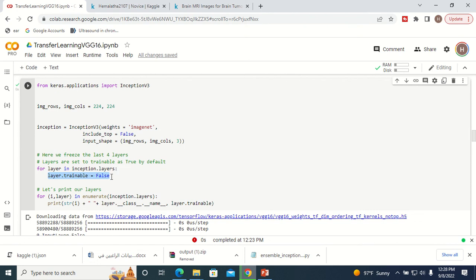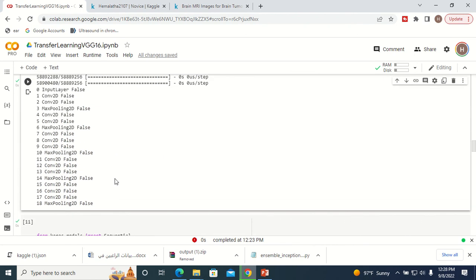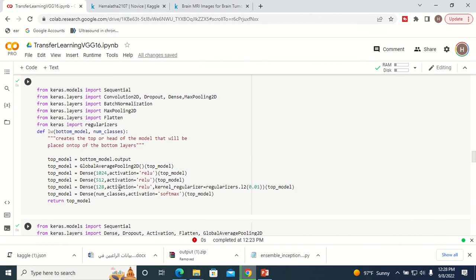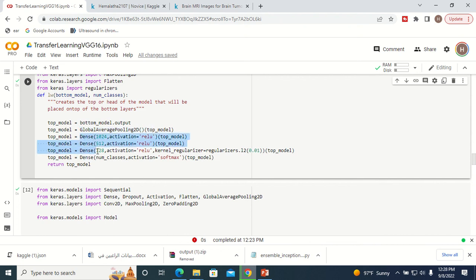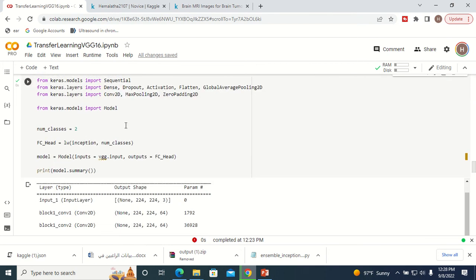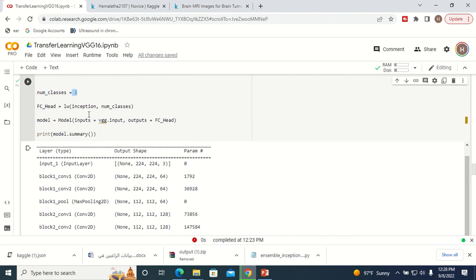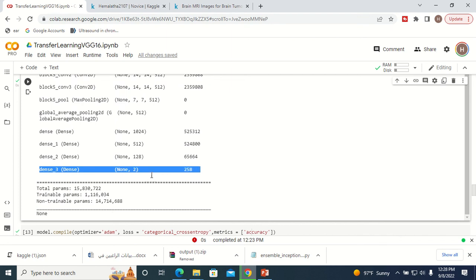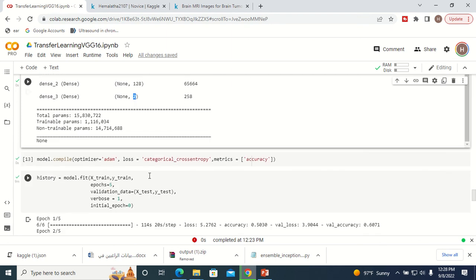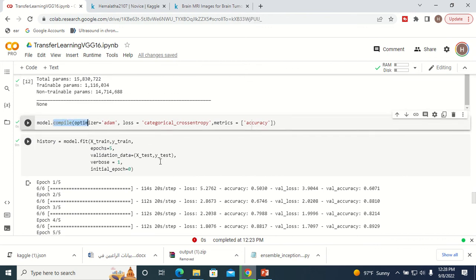The frozen layers are set to non-trainable — only the top layers will be trained. On top of the downloaded model, new layers are added: a global average pooling layer, dense layers, and finally an output layer with two neurons corresponding to our two classes. The model summary shows the full architecture including the newly added layers.